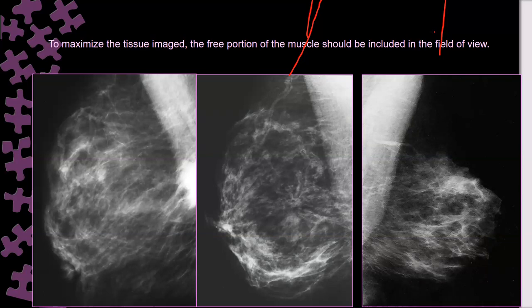Though it is a single criterion, it is an important criterion. Sometimes you might pass one criterion, but this criterion is indicative of missing breast tissue. Because the pectoralis is contracted, that prevents pulling the breast from the chest wall. That means most likely some of the breast is not included in the field of view. You can see it by your eyes, but still, being contracted, some breast tissue might not be included.